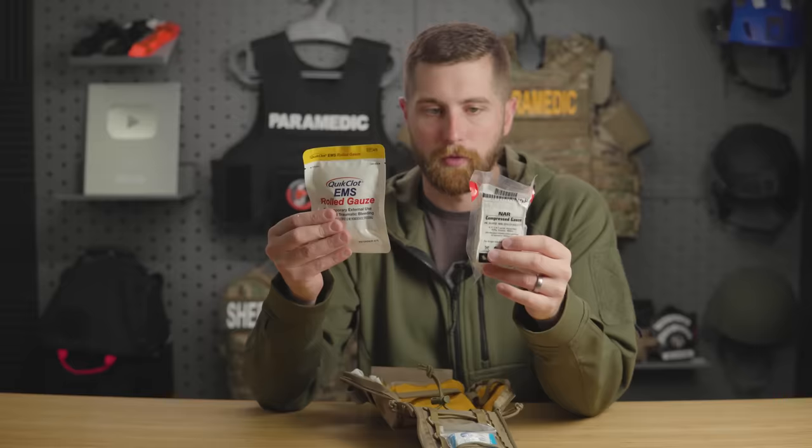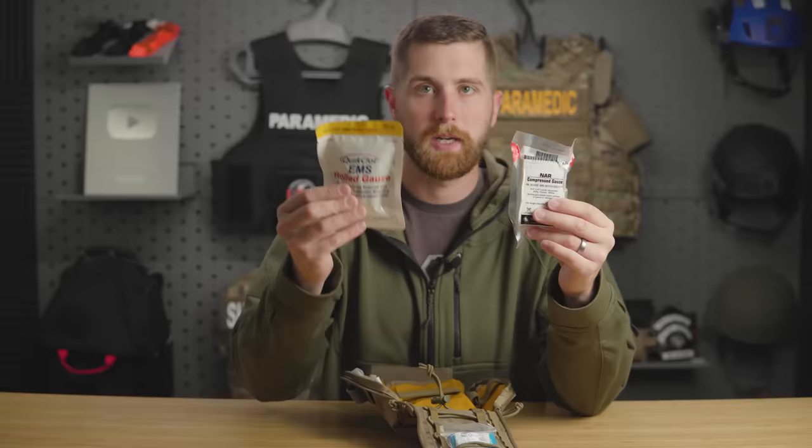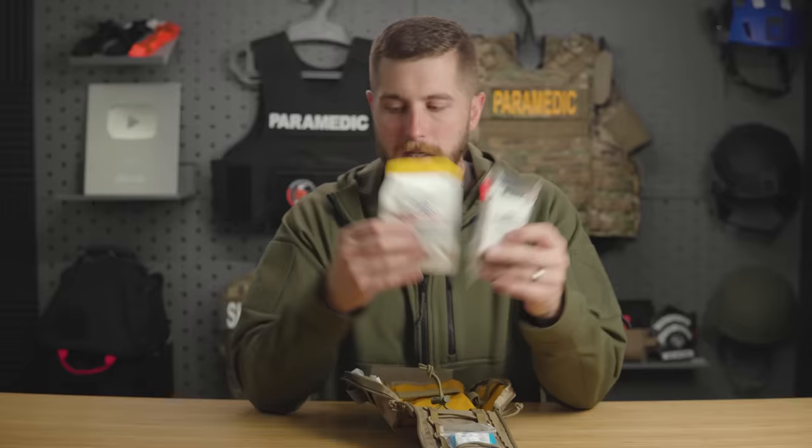And then I like having it as a secondary option if I've used this on somebody, if I need to pack more in somebody's wound, or they have multiple stab wounds. Now I have kind of a backup to that.